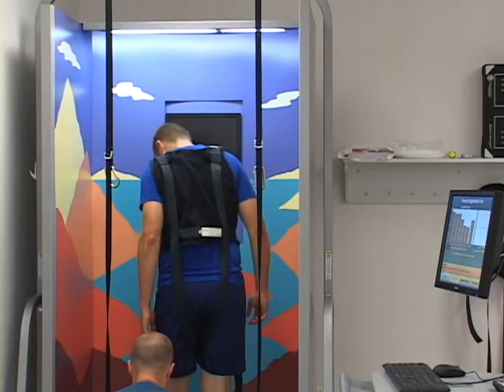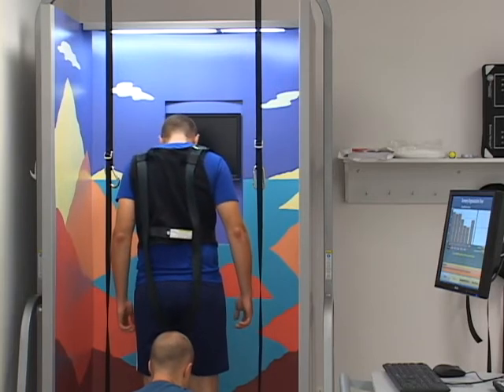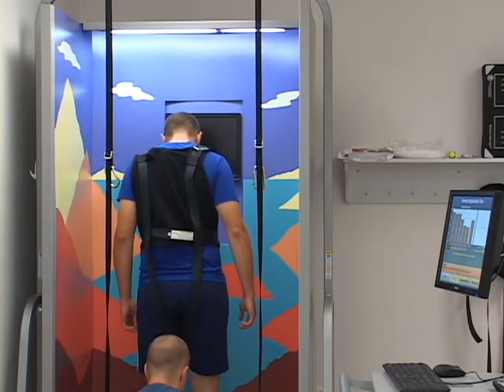The machine is able to take apart the various components so that we can test them almost individually. That way we can tell if somebody is having problems moving and staying upright because they can't really feel their legs very well — so they don't know where their weight is on the balls of their feet or how they angle their ankles — or if their visual system is giving them incorrect information, so they either don't see that they're moving or they see movement that's not really there.